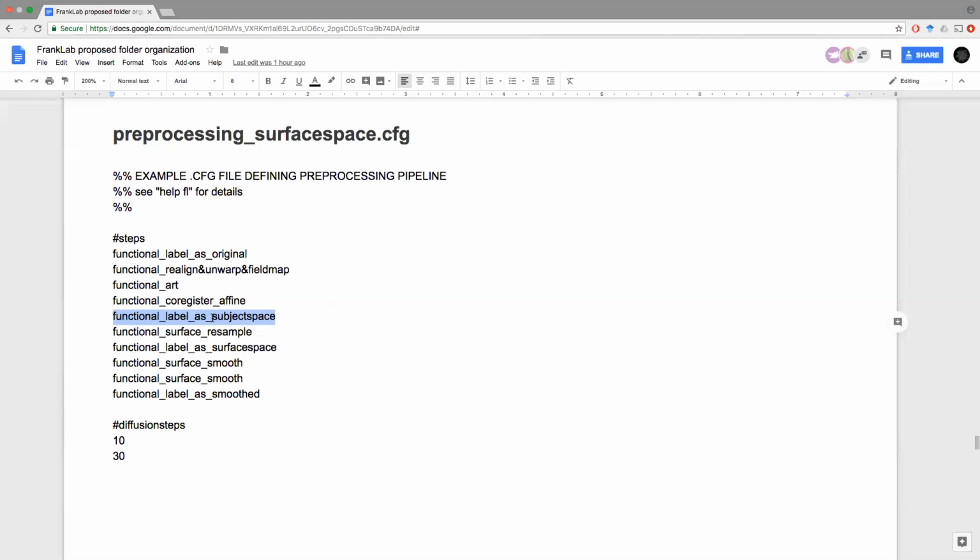The only thing that you get when you put your data in this average space is just a two-dimensional resampling. Once you have figured out what the actual cortical ribbon is, you want to resample so that the nodes that you are going to be using to represent the entire surface are relatively similar both across subjects and across each other in terms of the triangles that they look at. That's the whole normalization that is happening within FreeSurfer, and it is happening in this subject space resampling automatically for you.